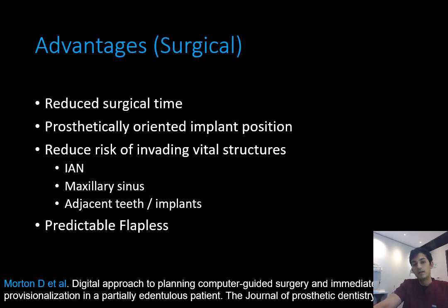The next thing that Dean Morton pointed out is that when you're doing your cases guided, there's a lot lesser risk of invading any vital structures. That's any neurovascular bundles, your sinuses, adjacent teeth for that matter, or adjacent implants, because you're staying as true to your plan as possible. Remember, a guide is only as good as the surgical plan that you created. If you planned it well, the chances are the case is going to go well, and you won't have these unwanted and unforeseen complications of invading these structures that we're trying to keep away from.